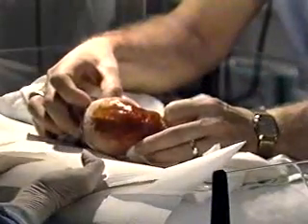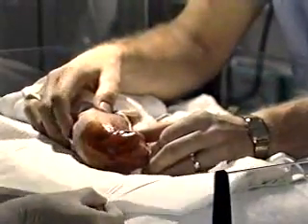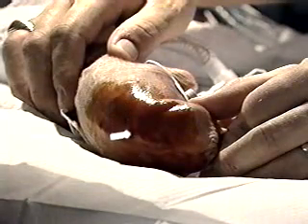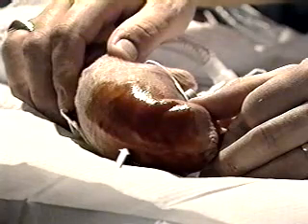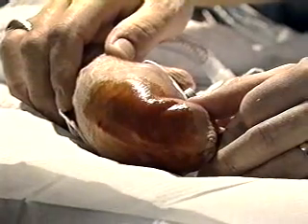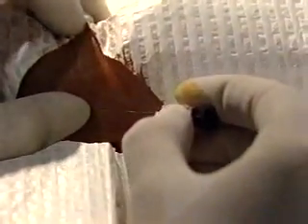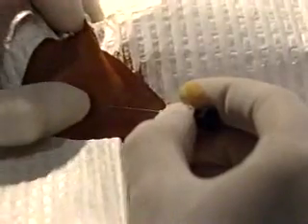The practitioner preps the back using the standard betadine scrub, places 1 sterile drape underneath the neonate, and then palpates for landmarks. Note the position of the spine and iliac crest. The spine is much more protuberant in the small neonate compared to the full-term neonate. A second fenestrated drape is used in this demonstration and is placed over the neonate's back. The practitioner palpates again for landmarks and localizes the puncture site. This position is held with the left thumb, while the practitioner picks up the spinal needle with the right hand.